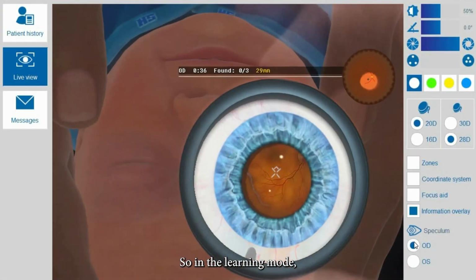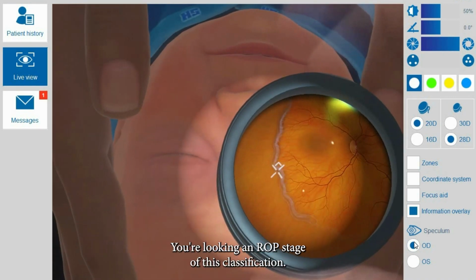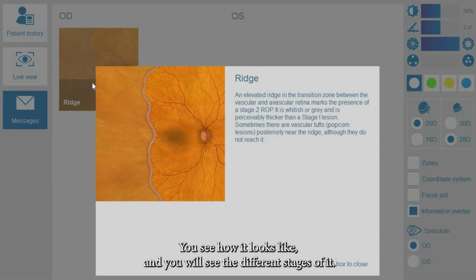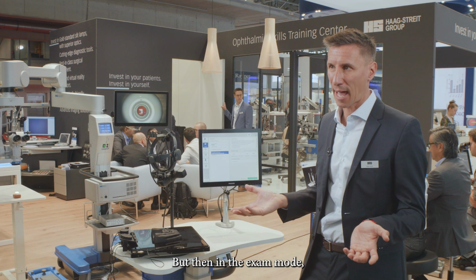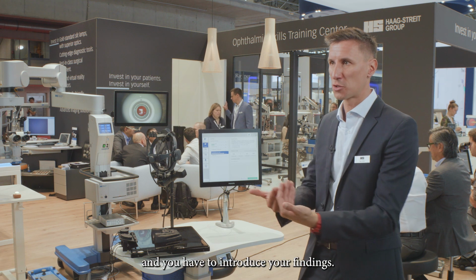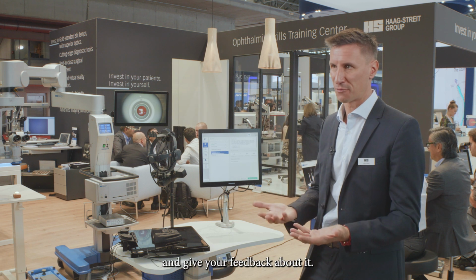In the learning mode, the simulator will tell you what you're looking at. You're looking at a ROP stage of this classification, you see how it looks, and you will see the different stages of it. But then in the exam mode, the simulator will challenge you with an unknown case, and you have to introduce your findings, you have to introduce your classification and give your feedback about it.